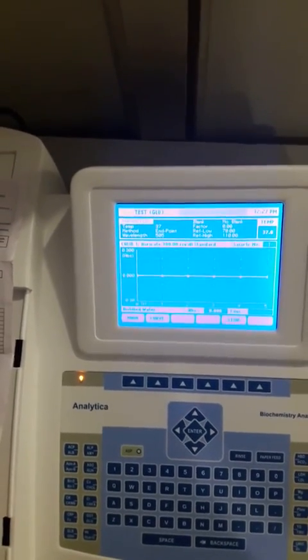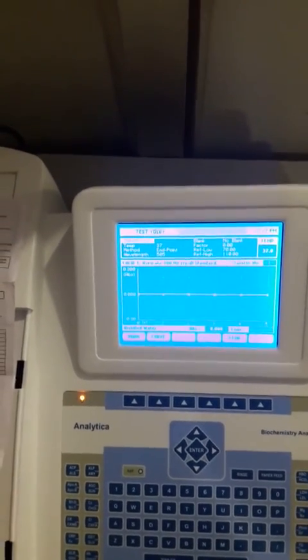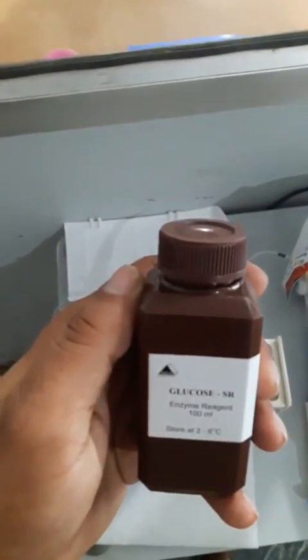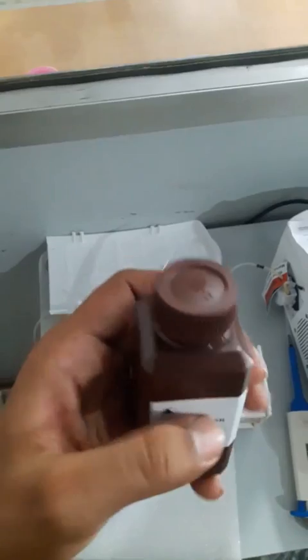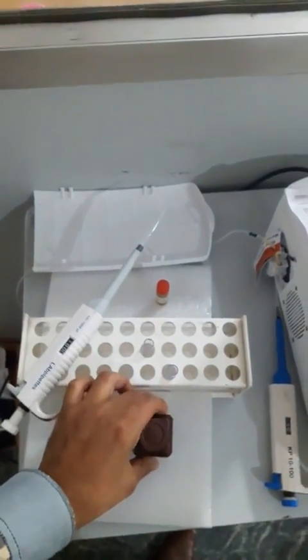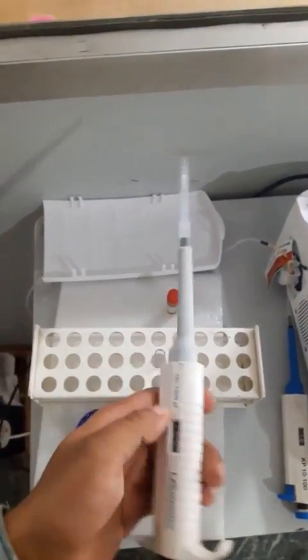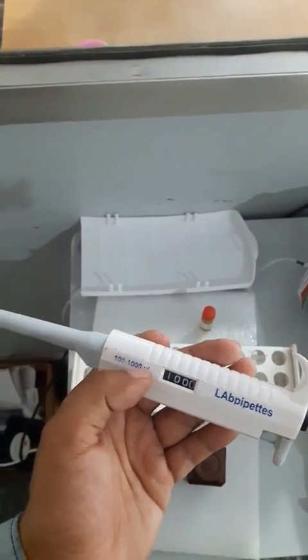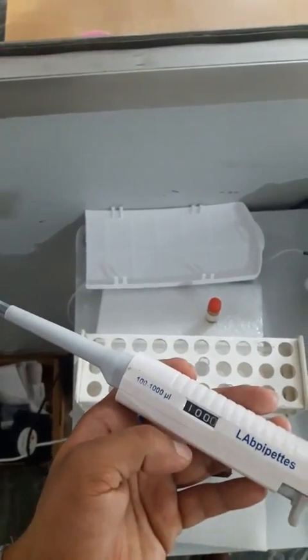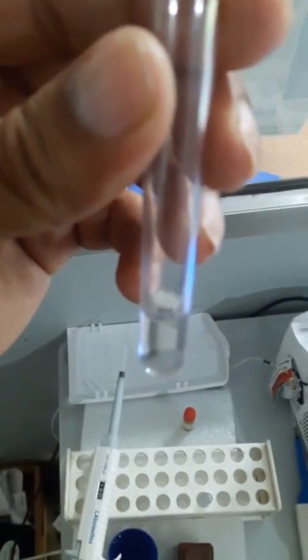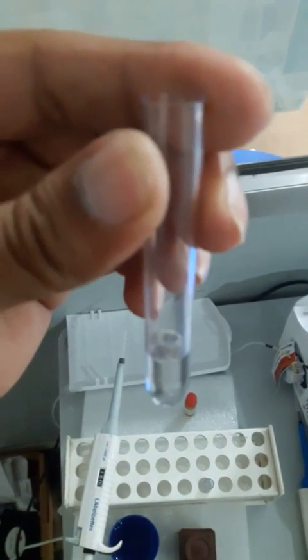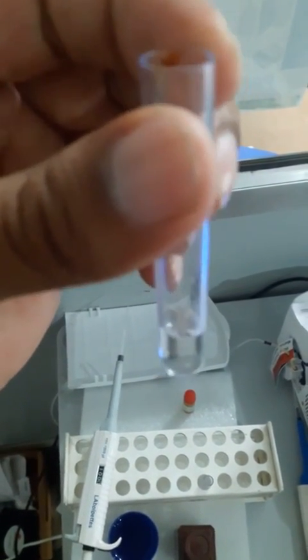Standard with reagent, and sample with reagent. This is our glucose reagent. I am going to use this glucose reagent — 1000 microliters — with this micropipette set to 1000, because we need a quantity of 1000 microliters as per the literature. Now I am going to mix 10 microliters of standard into this reagent.